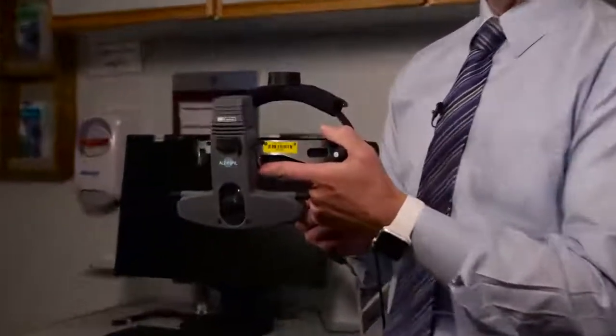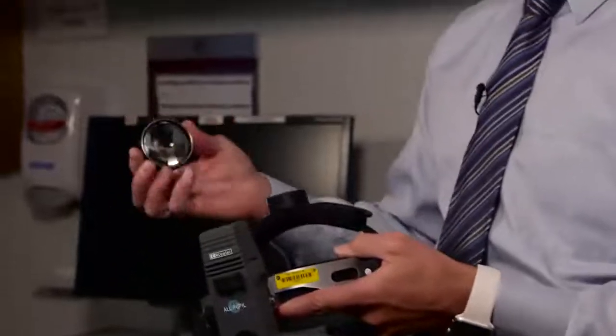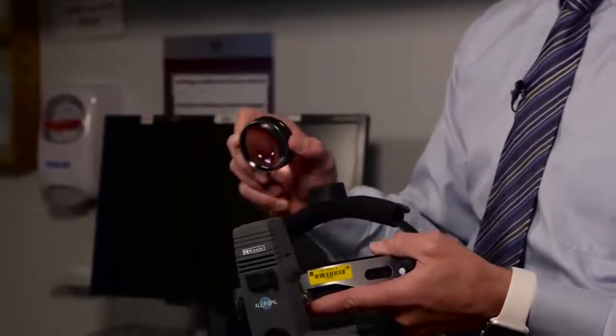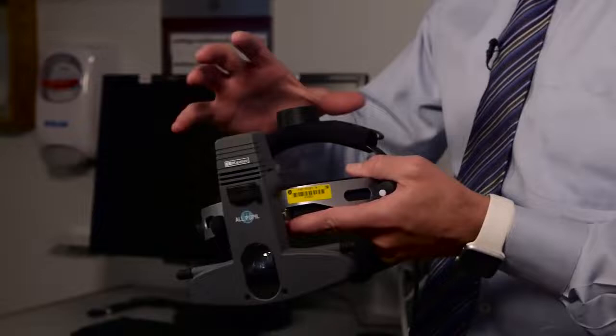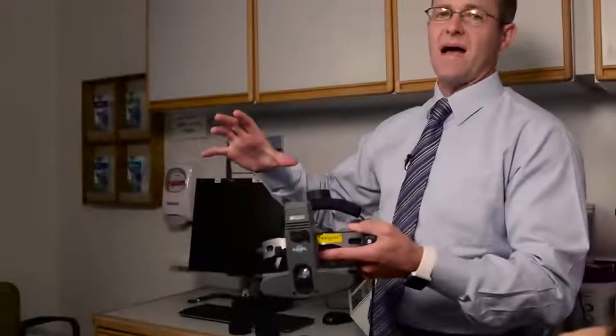One is called the indirect ophthalmoscope. This is the indirect ophthalmoscope, and then we use two main lenses, a 20 diopter lens and a 28 diopter lens. And these lenses allow for a less magnified but more wide field view of the back of the eye, thus being able to see out into the far periphery of the retina.